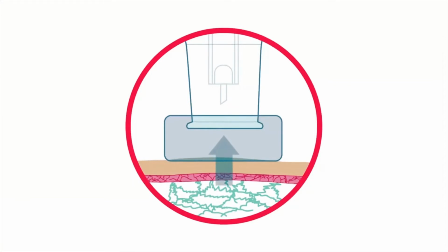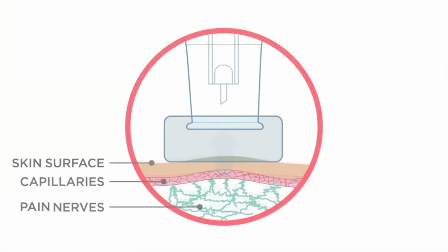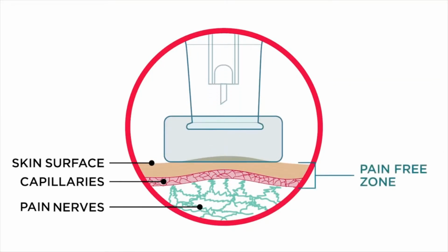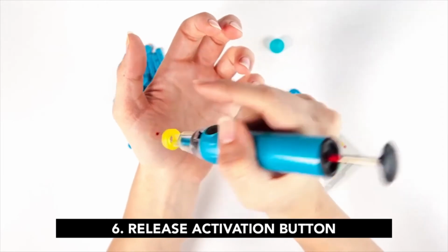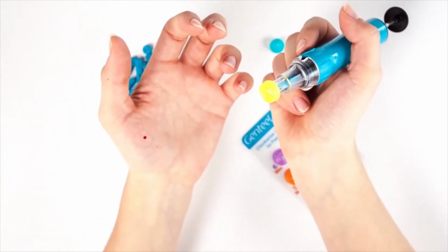By keeping your finger over the activation button, you are using the vacuum. This enables the blood drop to form on the surface without needing to squeeze. Remove your finger from the activation button after 6 or more seconds, which will release the vacuum.